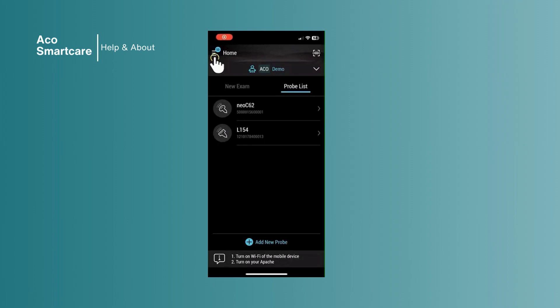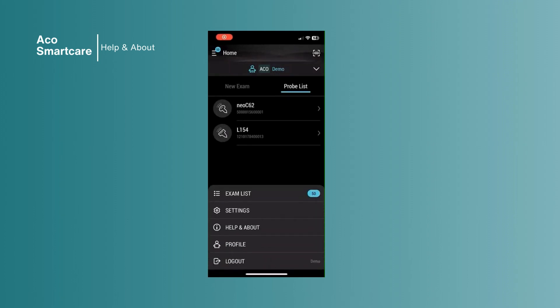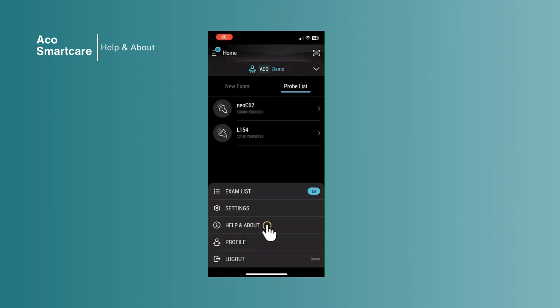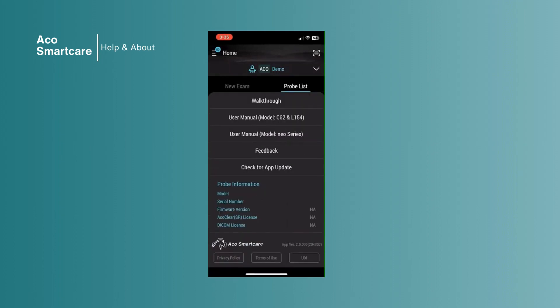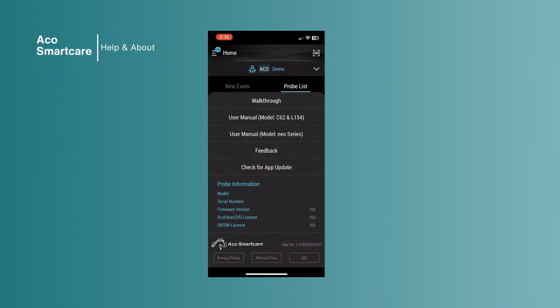Tap on the main menu and select Help and About for probe information. In this section, it provides a walkthrough for the app user manual, feedback, and an option to check for any app updates.